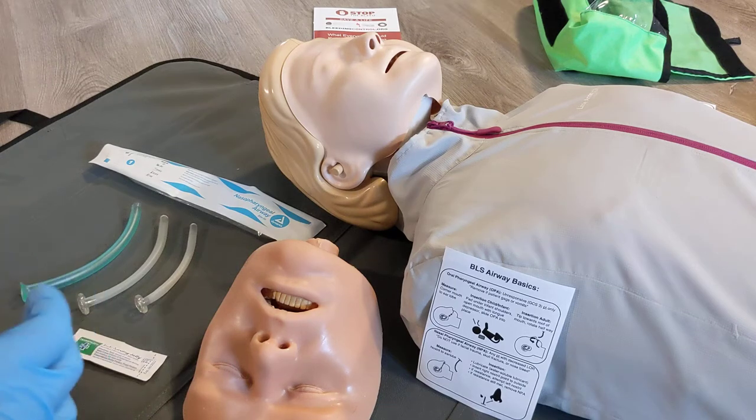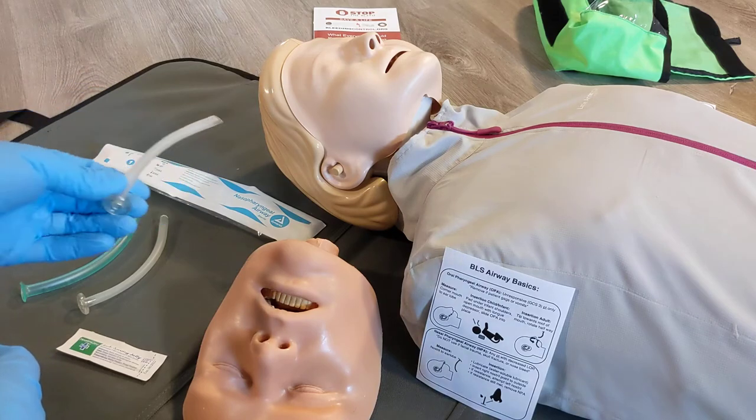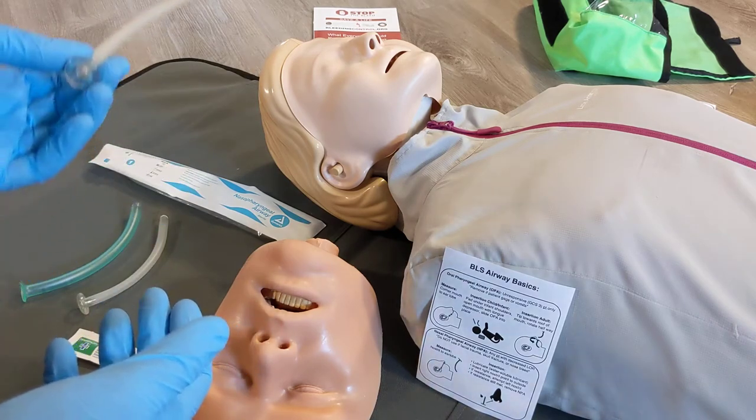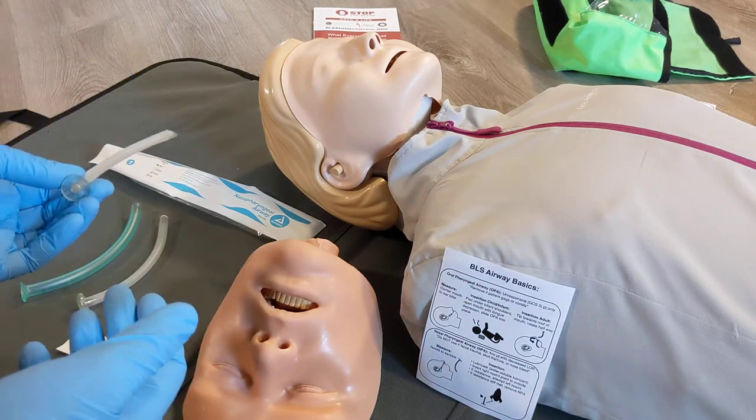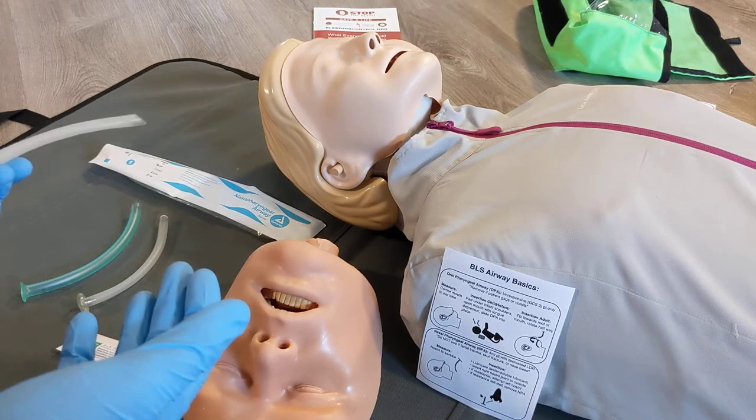This video is going to review the insertion of a nasal pharyngeal airway in an adult patient. Generally we don't do these on infants — we have different sizes — but we're usually using these on adults, at least at the civilian basic life support level.